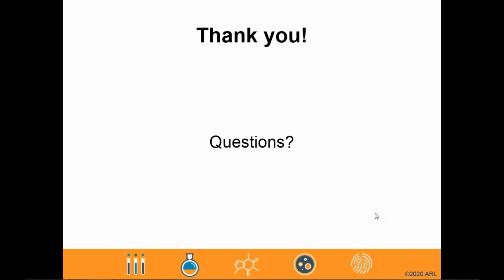Okay. Another question related to CO2 detection and specifically the BacT/Alert systems that you talked about. Given the limitation on detectable organisms, can a CO2 detection method be used as a single method to meet 71 requirements? Well, without going too far into the first portion of that question with regard to it being a CO2 detection method or otherwise, keep in mind that none of the rapid methodologies we discussed today satisfy USP 71.